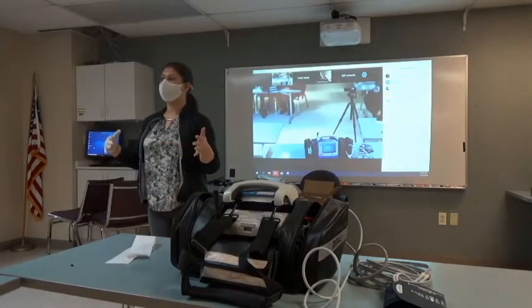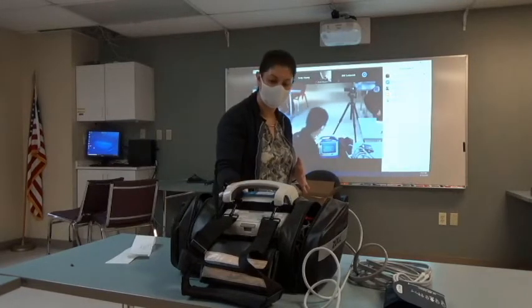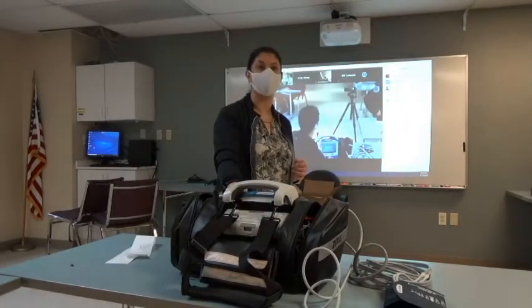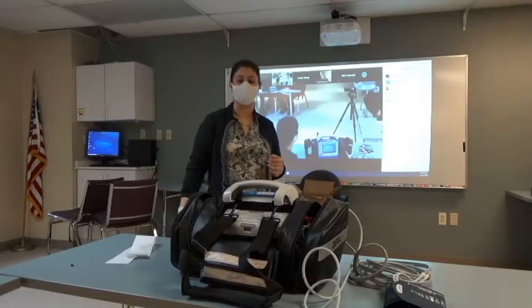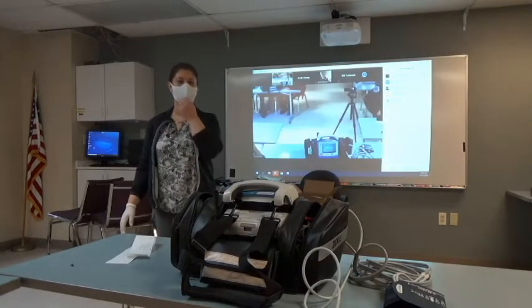Now the weird button push is you have to hit home to get to the transfer key, and then you're going to hit enter. So home and then enter, and we're looking for a green light to pop up on the top of the device again.